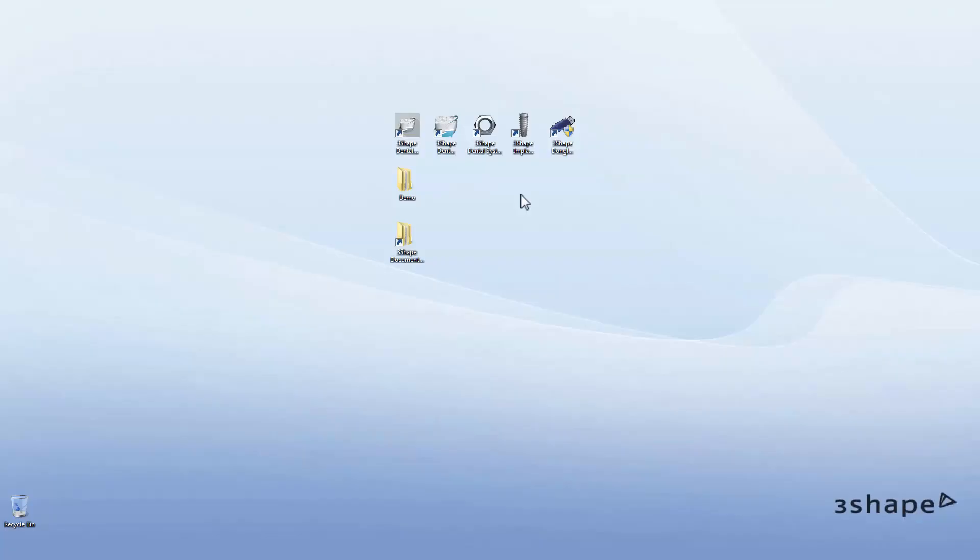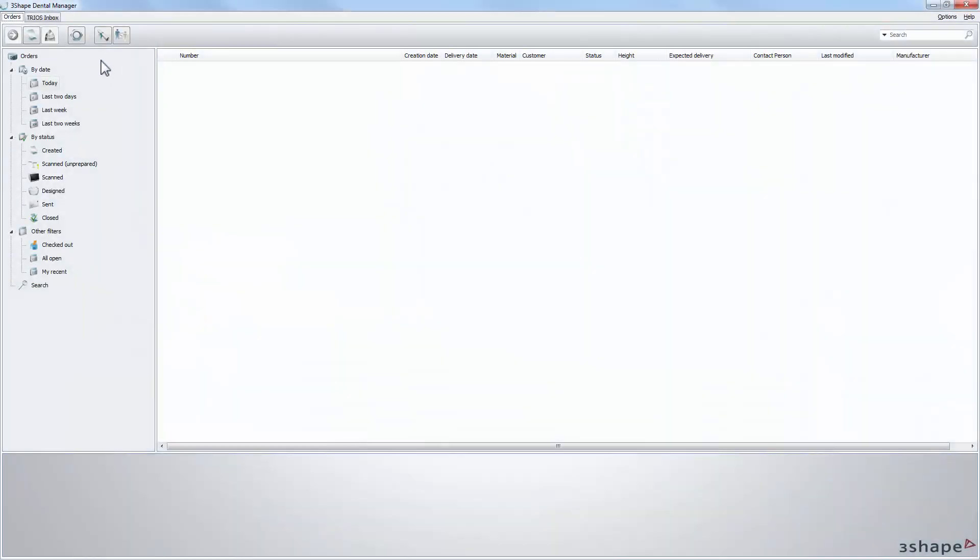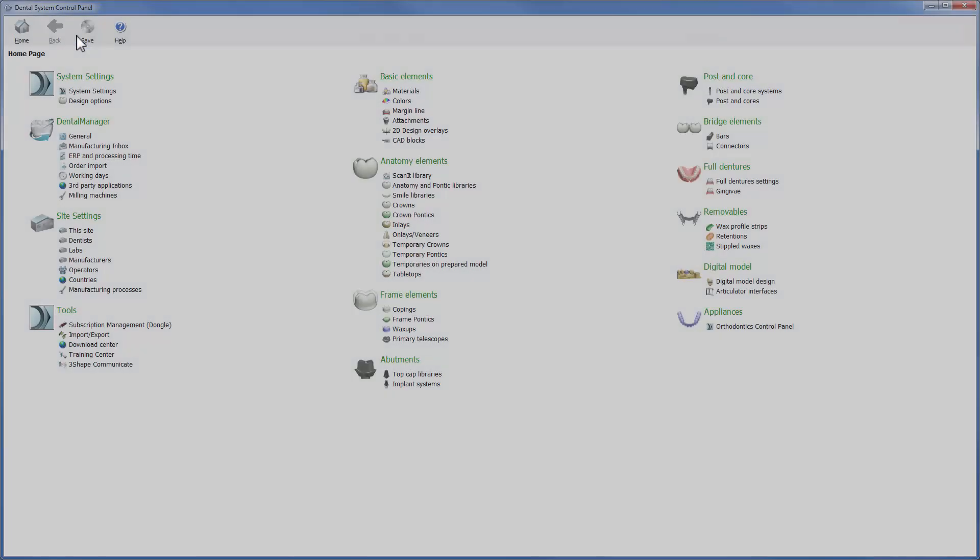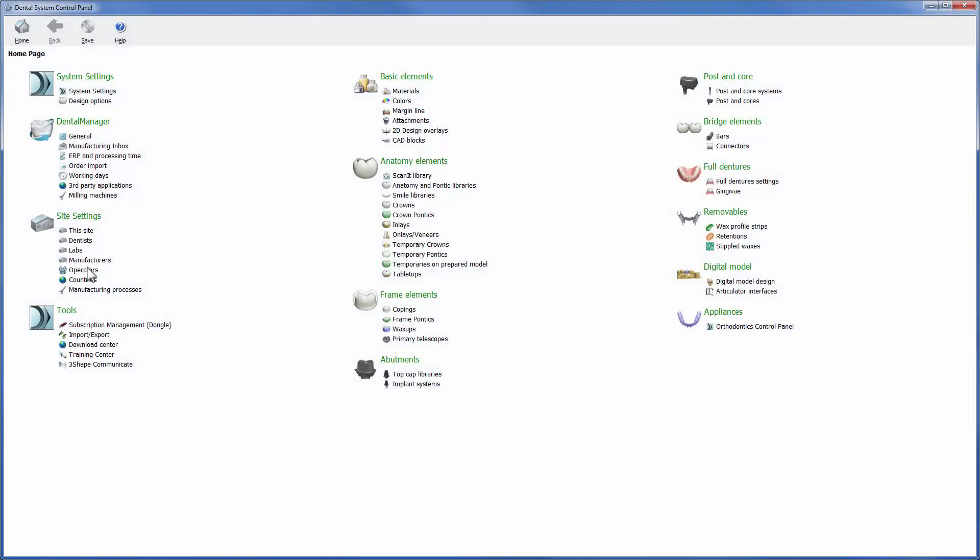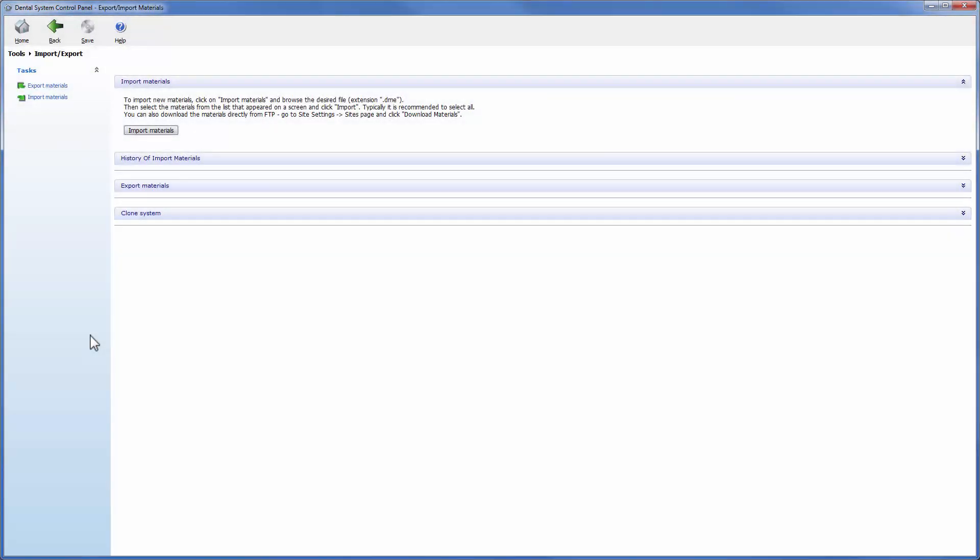To import the DME file, open the control panel directly from your desktop or from Dental Manager. To access import and export options, click on the import and export options.